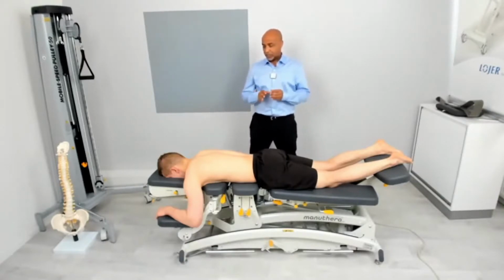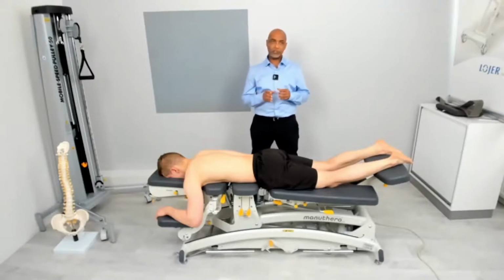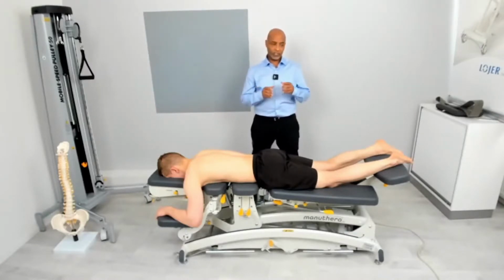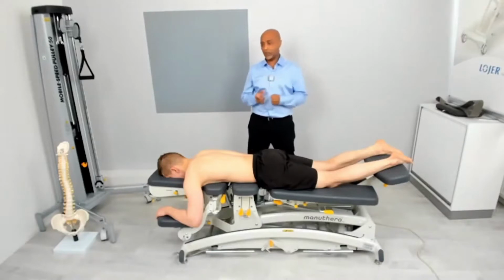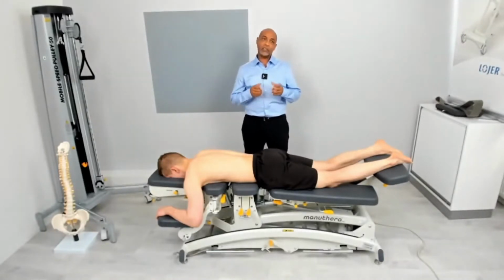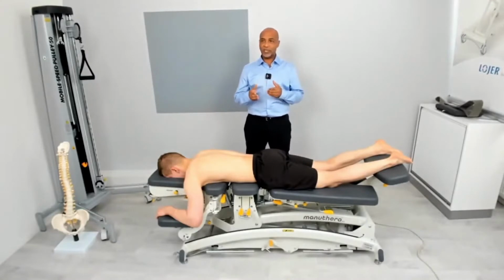With the assistance of Manuthera 242, the most versatile treatment table in the world, I have discovered, after a number of years working with different treatment tables, that this is by far the most helpful treatment table. It assists you in taking care of yourself as a therapist and also in achieving the best treatment result at the end of the sessions.